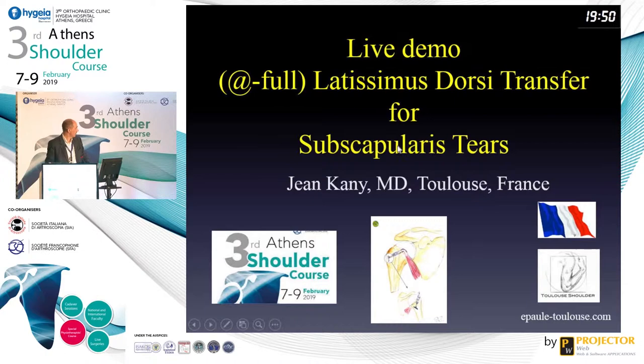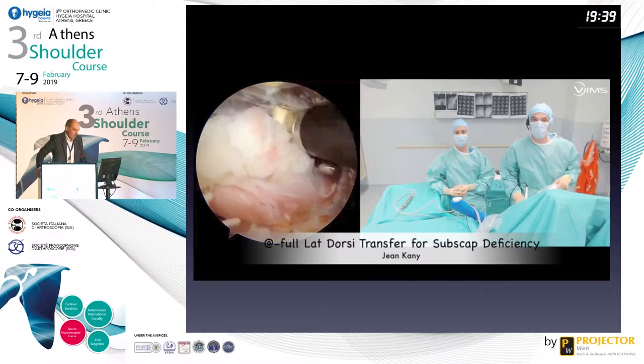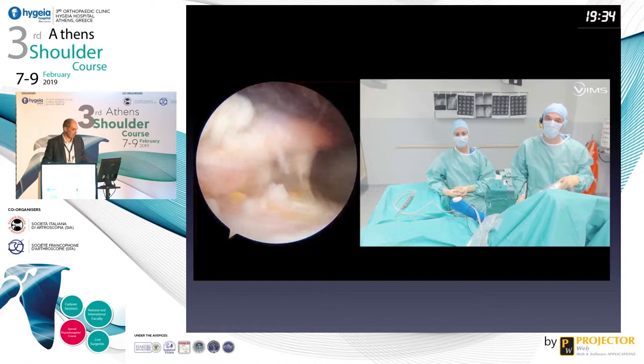So, biceps, let's go immediately. Remove that. When you go into this, this is the conjoint tendon, I think. Could you cut the sound of my movie, please? Yes, thank you. So this is the anterior part of the shoulder.